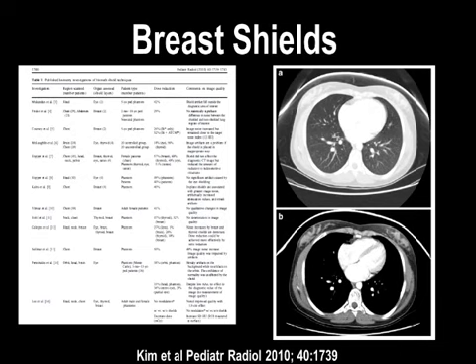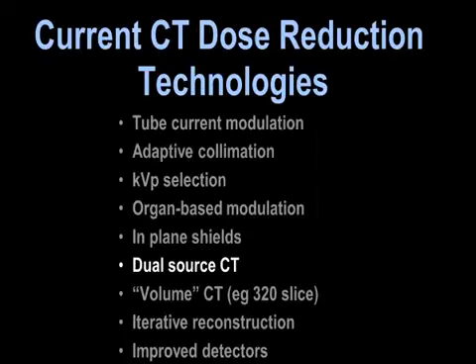But again, I'm not arguing for or against. I just want to say that the breast shields are not a bad way to do it. They're a different way to do it. There is some effect on attenuation, but most of chest imaging, unlike body imaging, doesn't use attenuation differences for diagnosis. Most all of that doesn't.